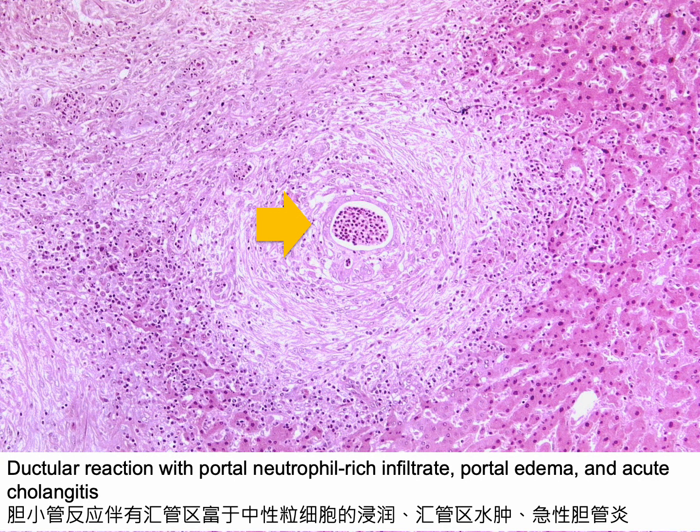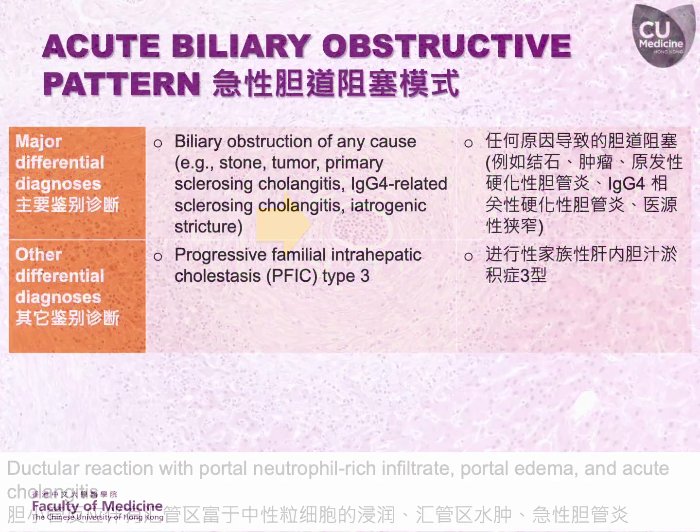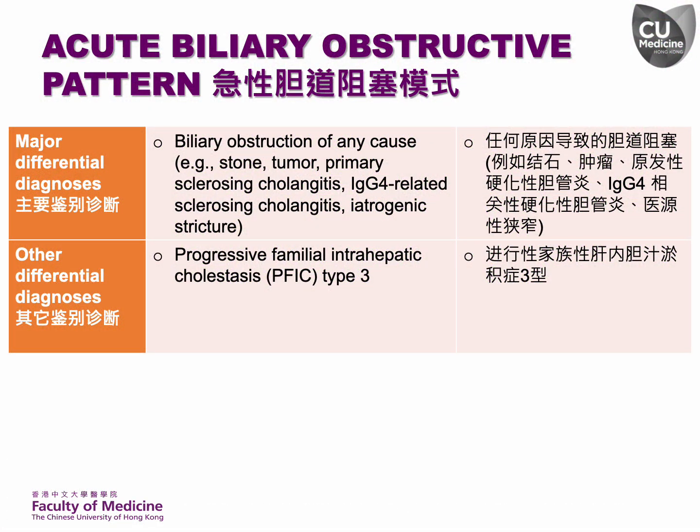Typical histological features of acute biliary obstruction are demonstrated in this excisional specimen from a patient with perihilar cholangiocarcinoma. This histological pattern is clearly indicative of acute biliary obstruction, regardless of the cause. However, progressive familial intrahepatic cholestasis PFIC type 3 should also be considered, particularly in older children, teenagers, and even young adults.